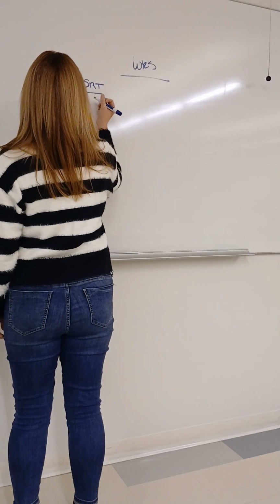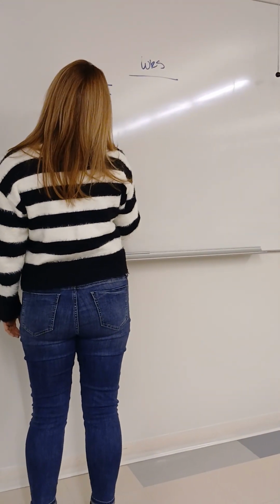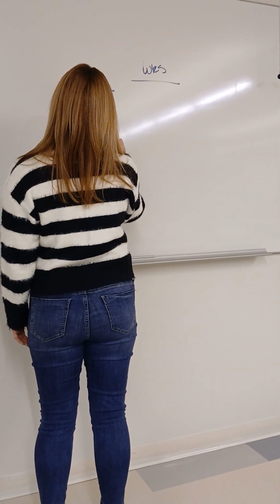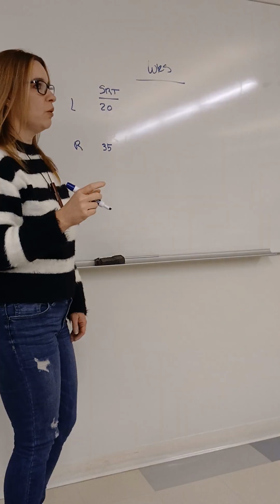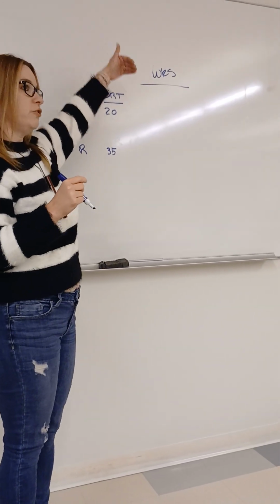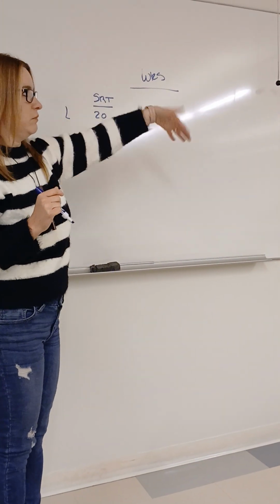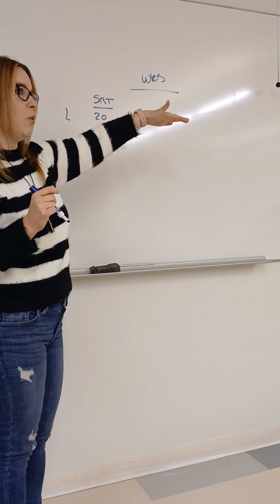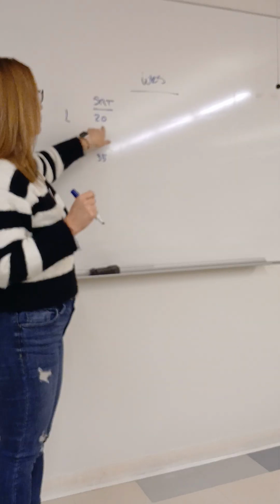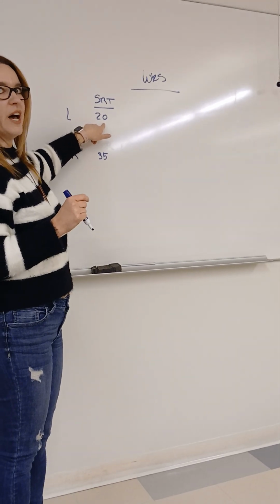Okay, so let's say we're at 20 and 35. So when it comes to word recognition, if the level you're doing your word recognition at is 40 or 60 dB more than the SRT of the non-test ear. So if we're gonna do word recognition here, what level are we gonna present that at?